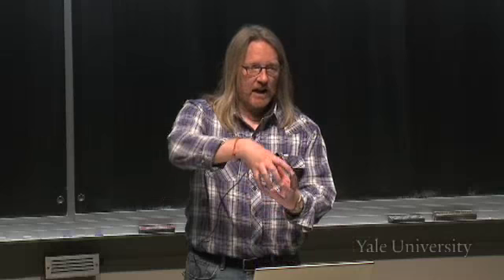And it's a three-dimensional object. And so for X-rays to pass through this whole three-dimensional object, a lot of the X-rays get absorbed, right? It's a thicker object than this bone. And so even though it's not as dense as bone, it appears whiter here because it's thicker. Right? And X-rays have to pass through more of it in order to get to the other side. The thicker the region it has to pass through, the more opportunity for those X-rays to be absorbed.